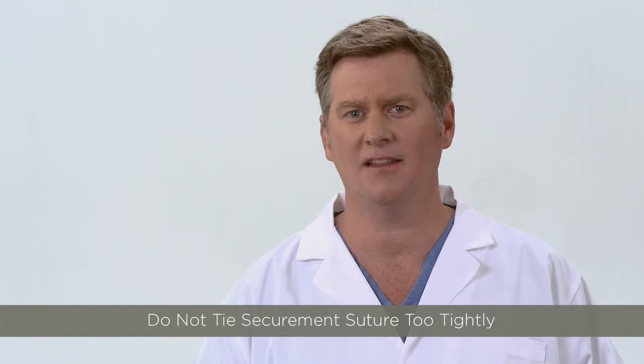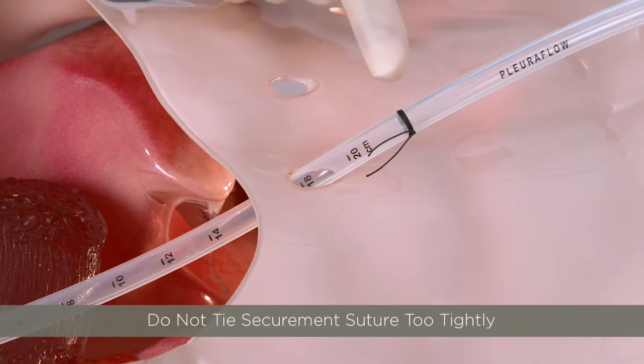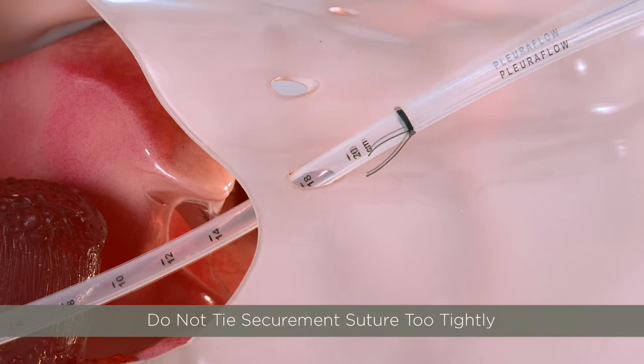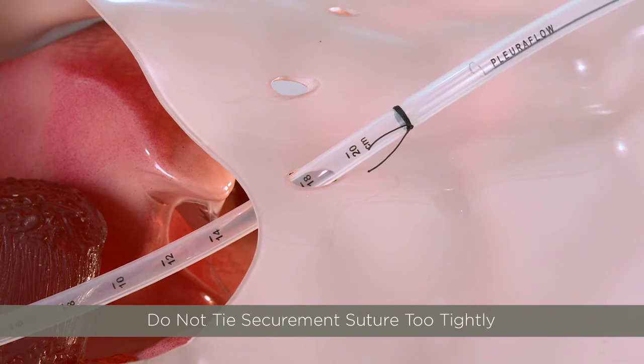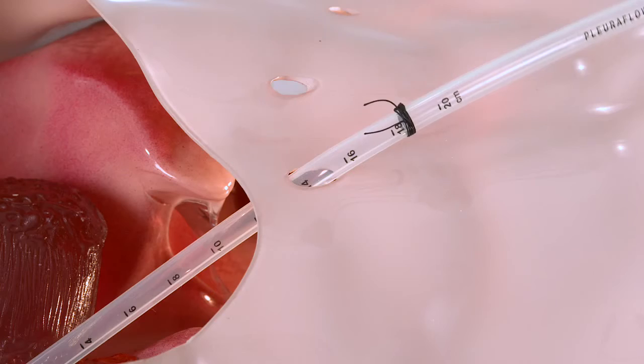Securing the chest tube too tightly to the skin can also dimple the silicone chest tube. Take care not to tie the suture so tight it creates an hourglass type obstruction in the lumen of the tube at the tie-down site.